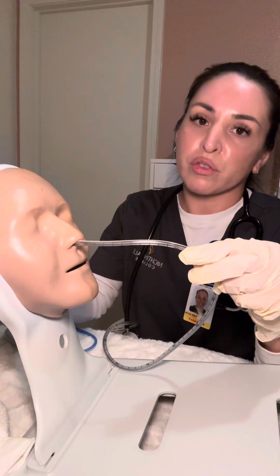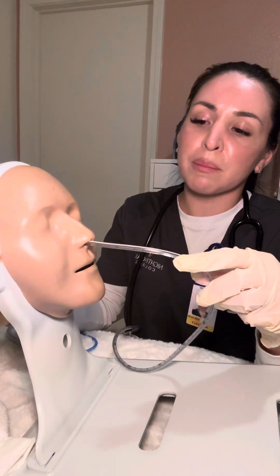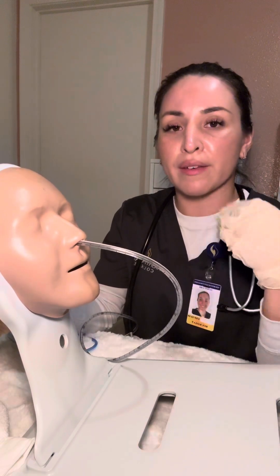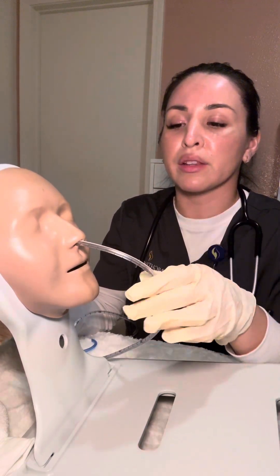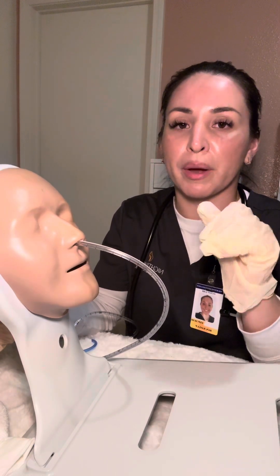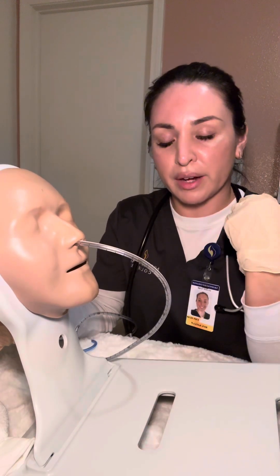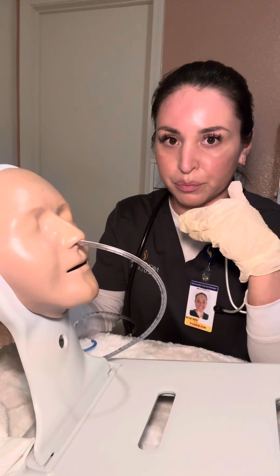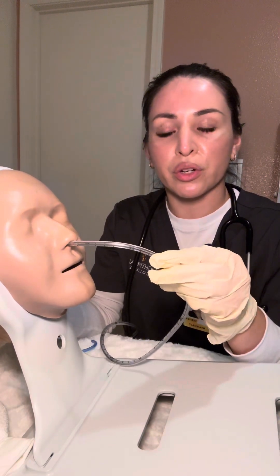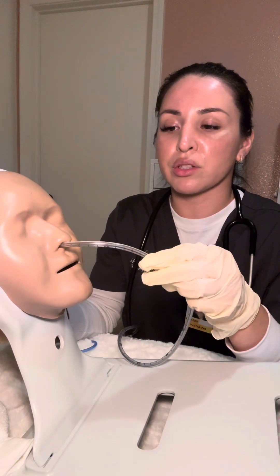For purposes of the video, I'm just going to grab it from the back here. Once the tube reaches the oropharynx, if the patient has any sort of gag reflex or raises their hand, we'll have them take sips of water — I'll have the cup of water nearby. With each swallow, we're going to push the tube further in, advancing about two to four inches with each swallow.